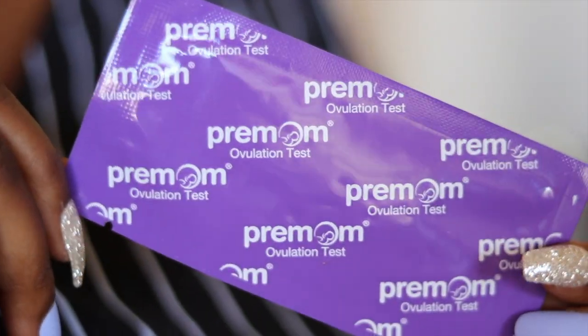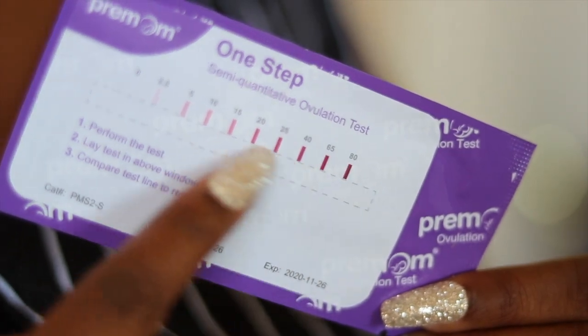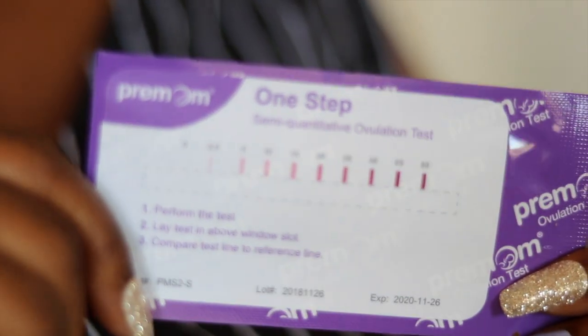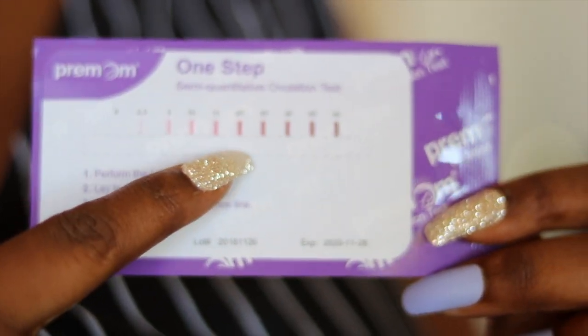I'll take it out and show you. These tests come in the same kind of pouch as the regular ovulation tests, but they're purple. The levels go from zero to 80. The control line stays the same — it stays super dark and won't change — but what will change is the test line. If you're at zero you didn't take it right, but it'll start around 2.5 and get darker as you approach your peak.